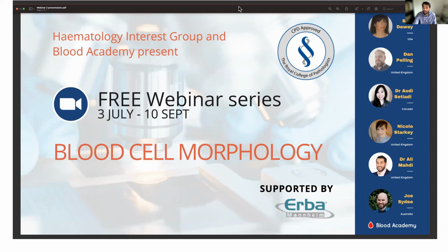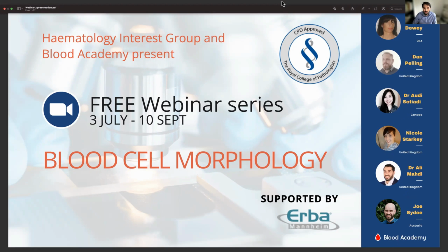I'm glad to welcome you all to this webinar, building on the previous webinar led by Dan Pelling, where we discussed the basic concepts and important factors involved in looking at blood film. I'm delighted to be joined by Nicole Starkey. We have three really interesting red cell cases to go through.